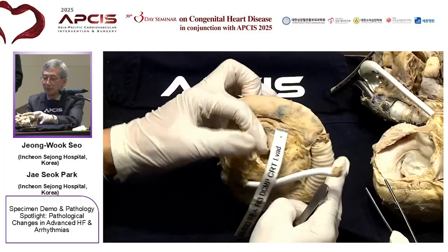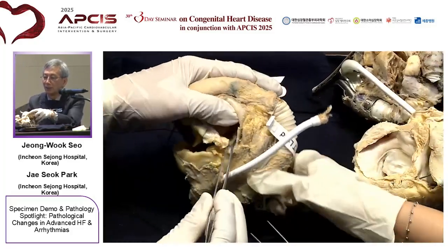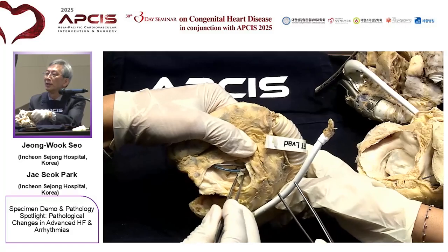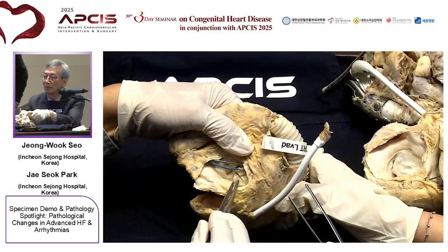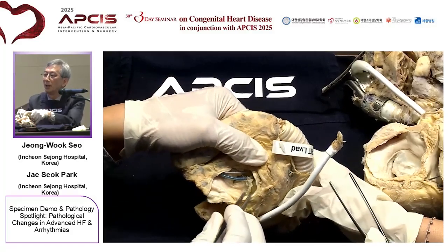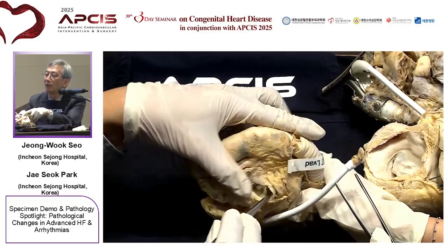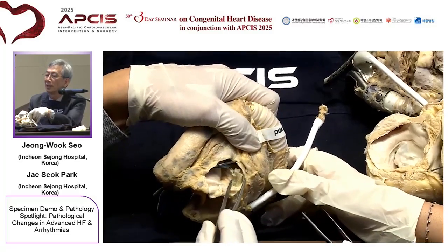And in this particular case, the CRT lead orifice has fibrotic tissue surrounding this CRT lead. In this case, the fibrotic change around the CRT lead was extensive. So coronary sinus blood flow may be reduced due to this fibrotic change around the CRT lead.